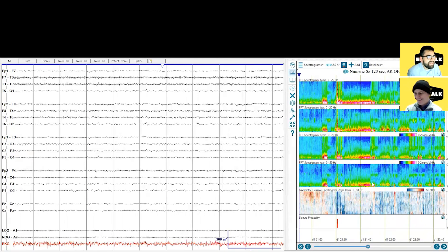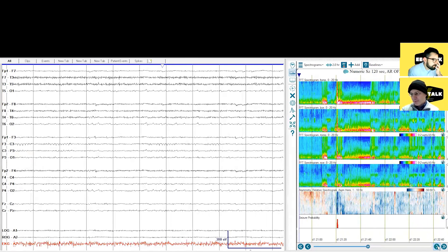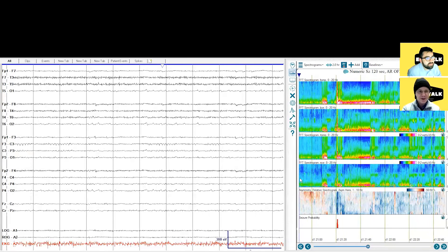I think we need to see some more seizures from this patient — they're here to find out whether surgery is an option, right? I think on the positive side, that seemed to be a pretty well-localized seizure. We might be able to help this patient.